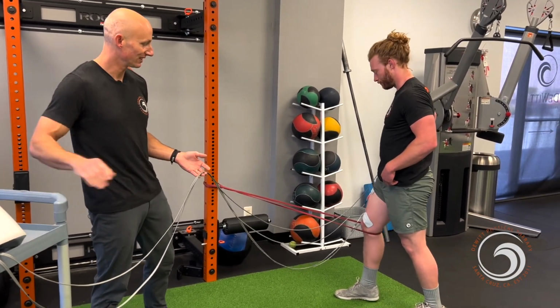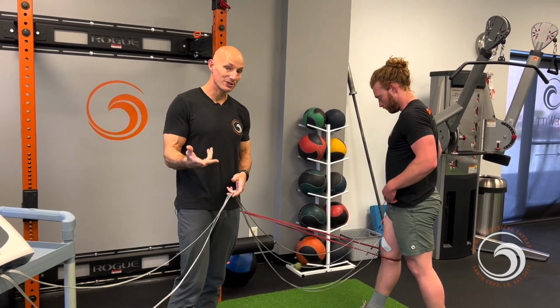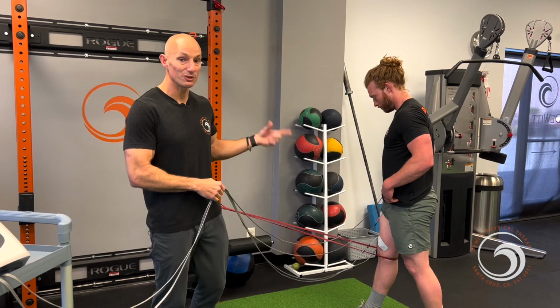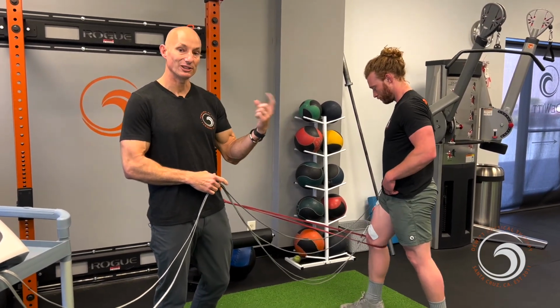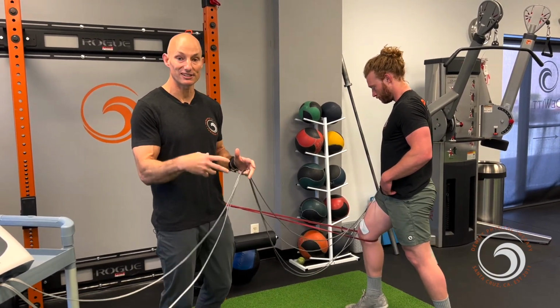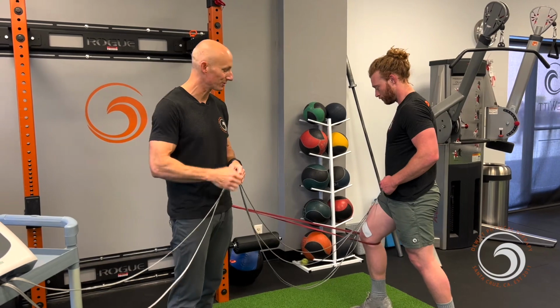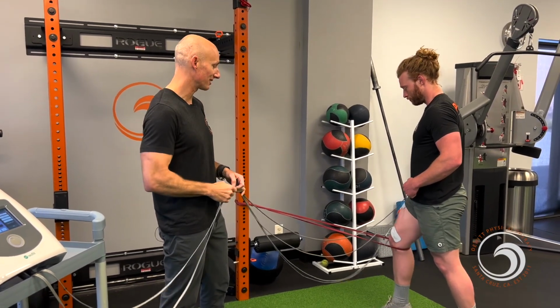That's great. And so now what we've done, and this is why it's a lot different than your Russian stimulation, it's just on and he's moving, but we're also using that quad, and now we're adding in that glute and hamstring because we want it to be a force couple. We want all these movements and these muscle groups to work together to produce this functional movement. And so it's really syncing everything in, optimizing some of these movement patterns.